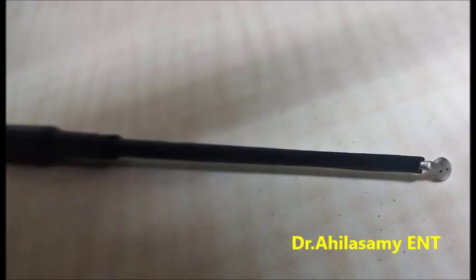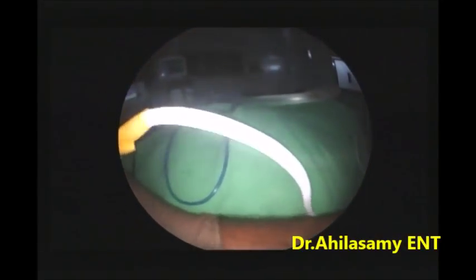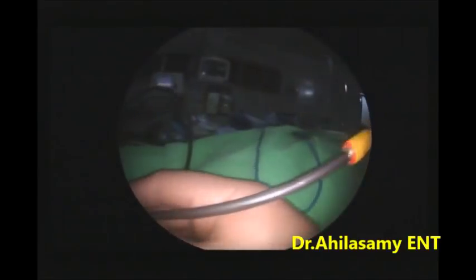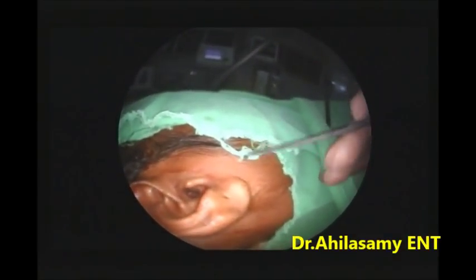When you use this monopolar round knife and elevate with this, any bleeding — it's wonderful. This will be the game changer in future days for endoscopy ear surgery. This round knife works as an attachment to the monopolar cautery and is insulated except the tip.